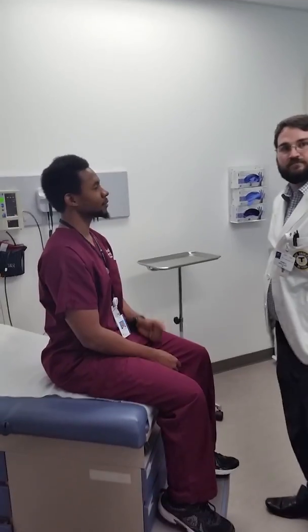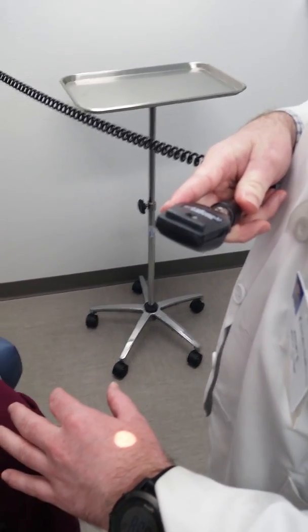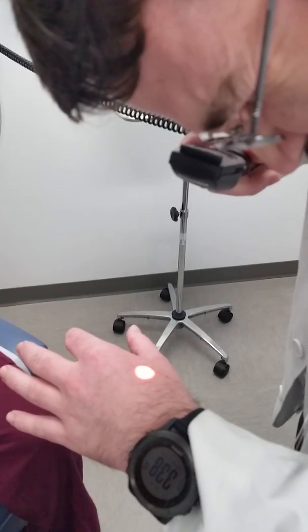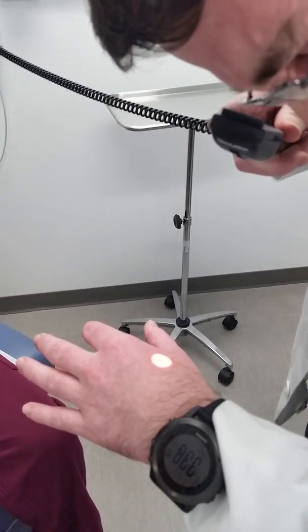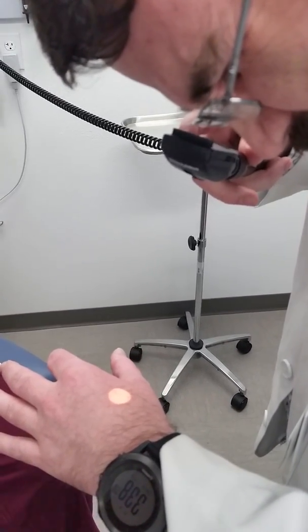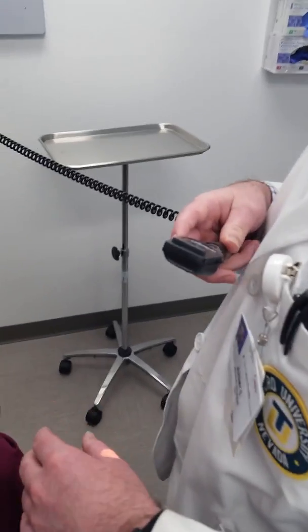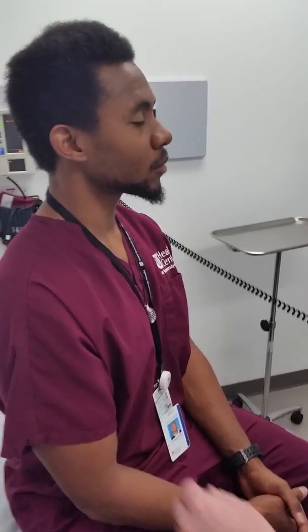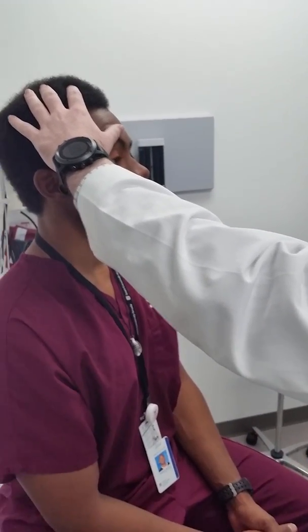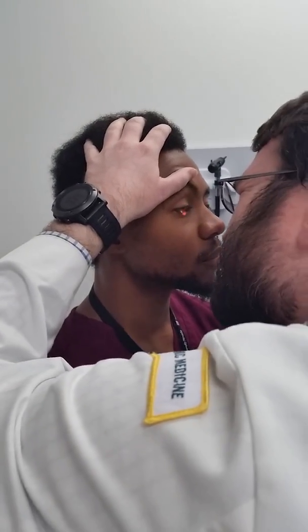We will now move along to the ophthalmic examination. The student doctor has already focused his ophthalmoscope on his hand by setting the diopters to zero and visualizing a fixed distance of approximately 12 inches to the back of his hand. He then moves either upward — negative — or downward — positive — to focus at a fixed distance, so he knows what that distance is focused. He then moves to the patient's face, with the student doctor looking through his right eye to the patient's right eye. Note that the doctor is holding up the patient's brow while moving in and focusing on the lens.